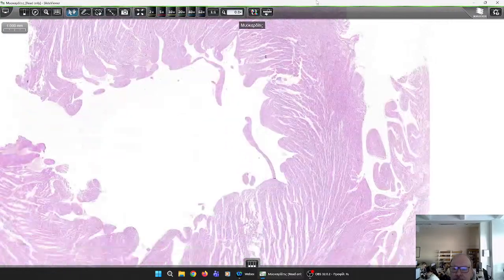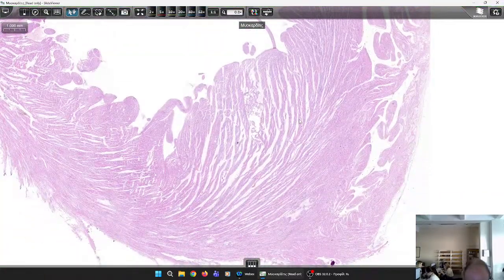What do we see here? In contrast to the infarct, in which the inflammatory process is limited to the necrotic area, in the myocarditis specimen, we can see lymphocytic aggregates dispersed in various areas throughout the whole myocardium. Of course, this is an autopsy specimen, so we can examine the whole heart. Very rarely are biopsies taken from hearts that we suspect have myocarditis.